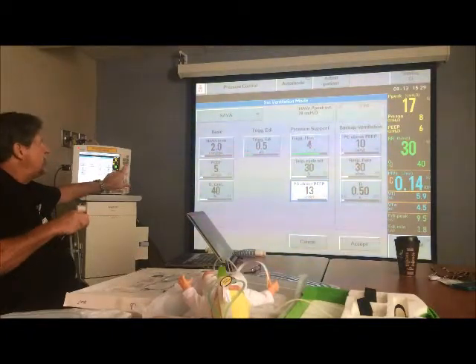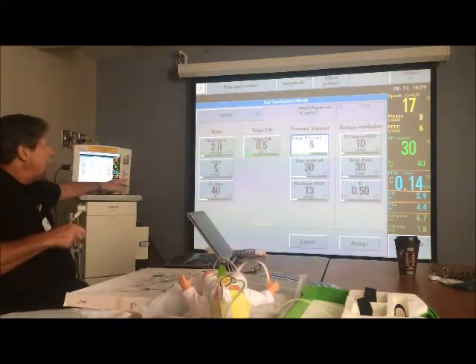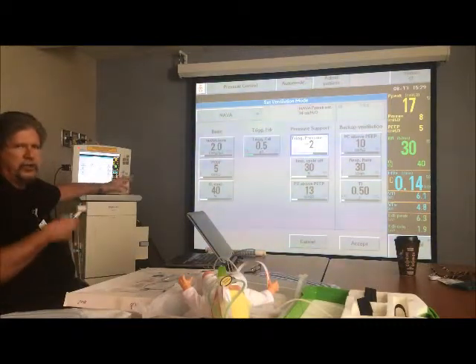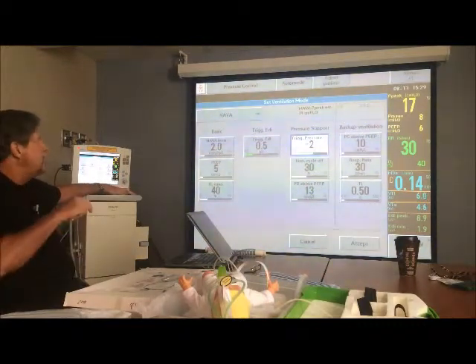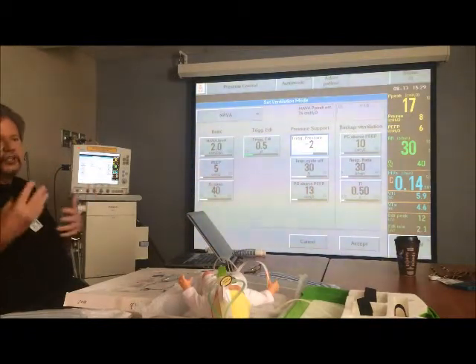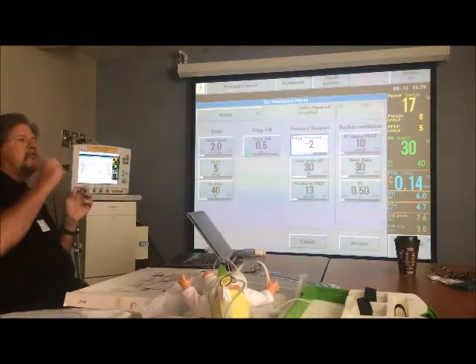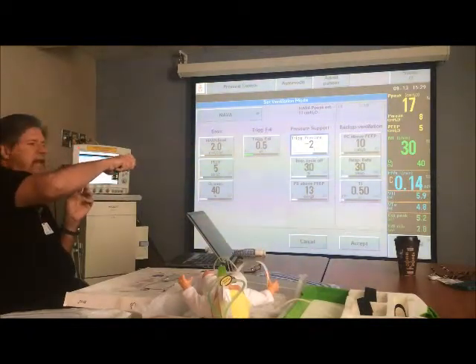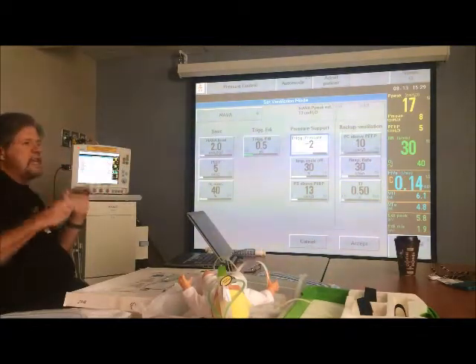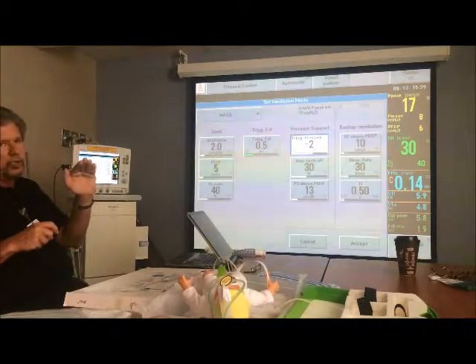The thing is that you'll always want to set your pressure support trigger at -2. It will default to 5 like it does in all the modes, but you always want to set it at -2, because in the event that there's some leakage and auto-cycling occurring, you don't want the ventilator to be triggering on the negative pressure trigger or the flow trigger before the EDI min, or the trigger threshold, is met.